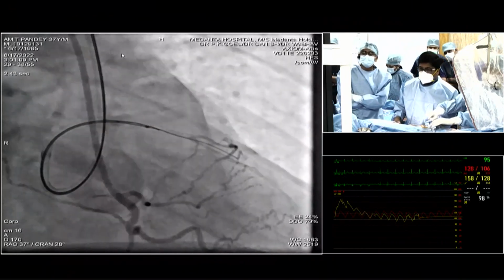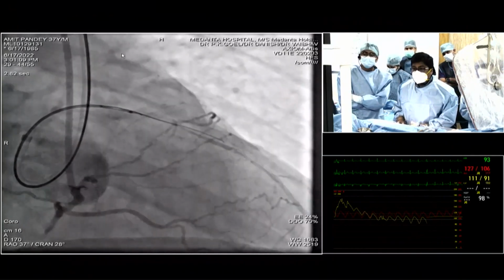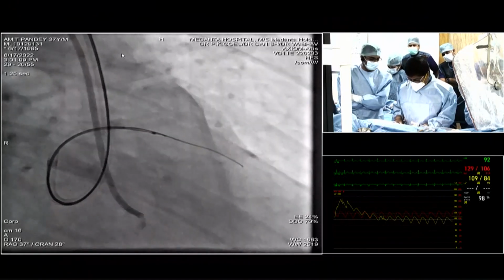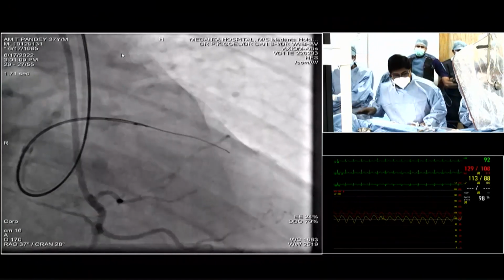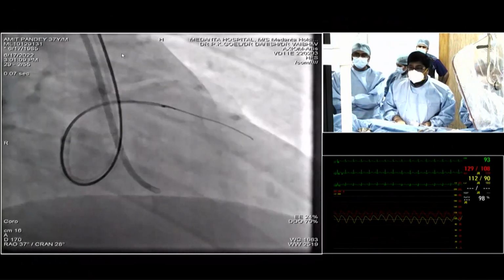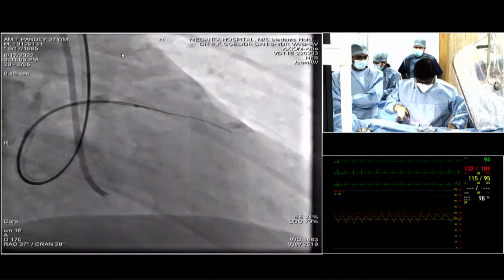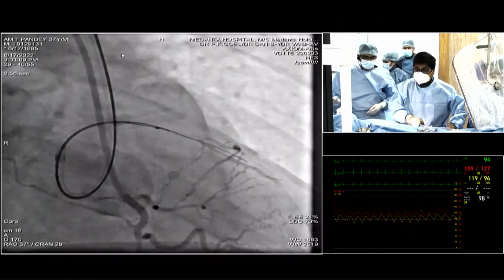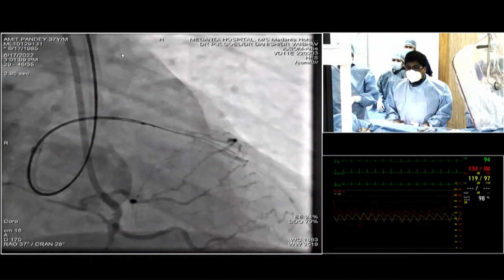Still here, I would suggest going for a parallel wire. Which is what he's trying to do right now. There are already 2 wires. But there is a technique by Dr. Goel himself: he actually has an orthogonal projection and sees the wire position. Goel actually introduced the technique to India, even though Kamura does it in Japan. Use this as the main wire. Yeah, the 3D wiring.